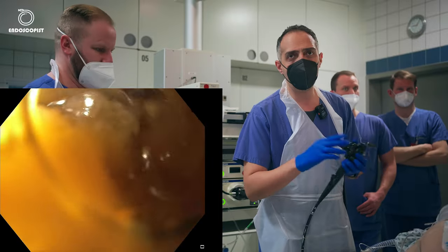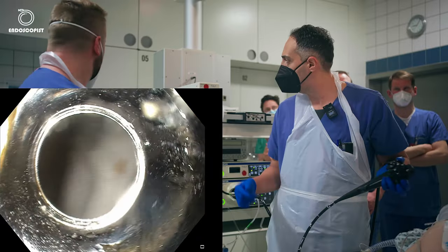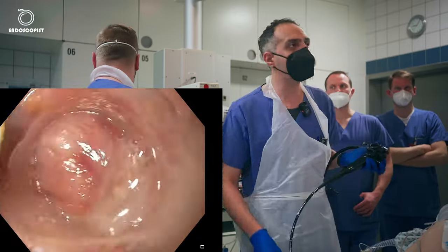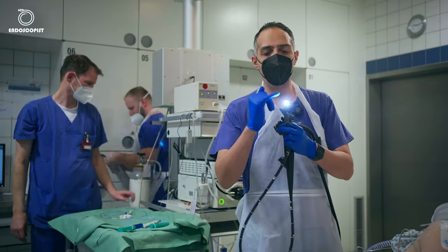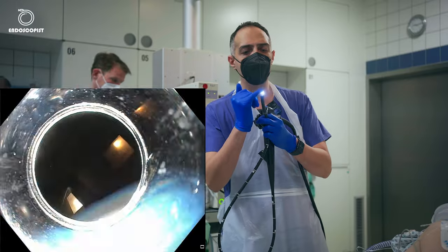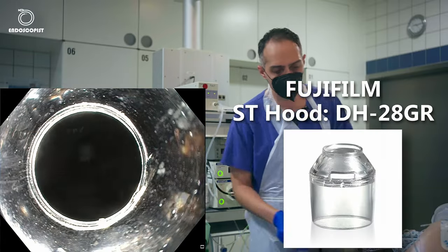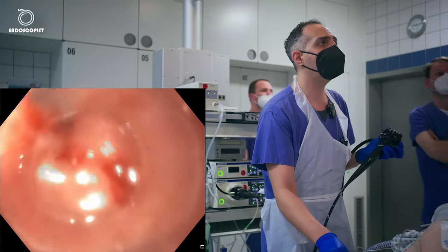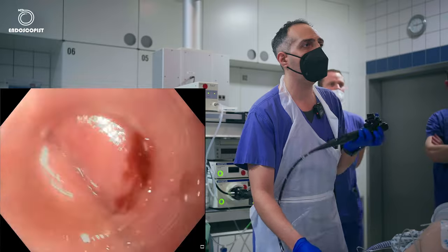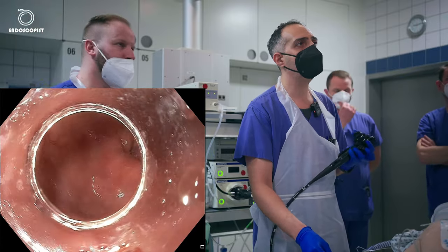So I will keep cleaning it, I will stop the video, and then I will show you after we finish this process. So it took us like 10 minutes to empty the esophagus. We have now the cap from Fuji, which is a cone shape, which will help us to do the tunnel. We'll start now again with our endoscopy. As we can see here, the esophagus is dilated.